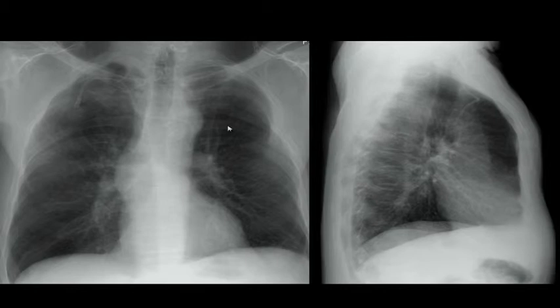If it's in the aorta, it's a traumatic insertion, right? They were struggling back and forth, overzealous physicians trying to put it in. I thought maybe they just missed the subclavian artery for the vein. But I guess not, because the aortic arch is up here and this is down lower. So could they be in the hemiazygous?